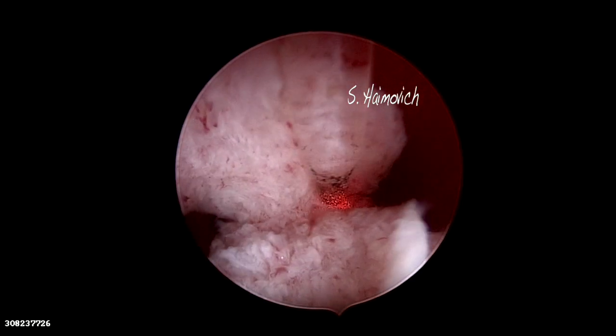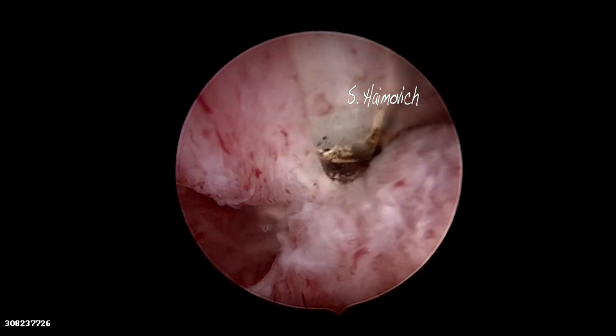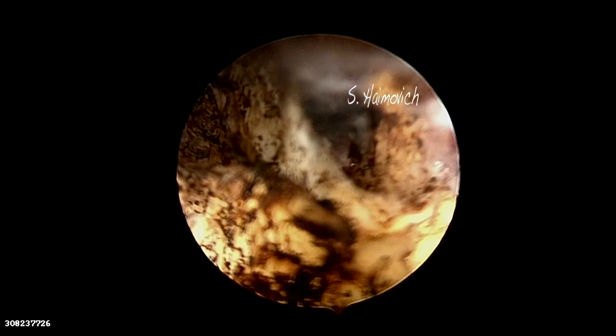We decided to use diode laser. Diode laser cuts and coagulates at the same time with a dispersion of heat of only half to one millimeter, and by this it does not reach the myometrium and the patient does not feel any pain. Notice how fast it cuts from one side to the other.